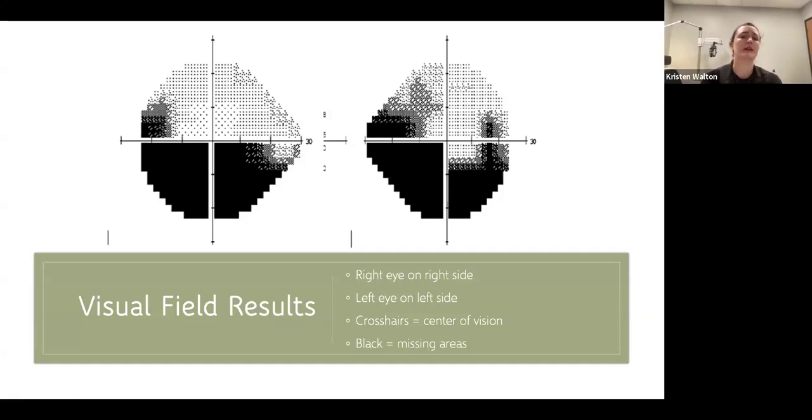I think I typically prefer fovea on. Just getting as much feedback from the machine is what I would prefer. But it's definitely doctor preference. Just like when patients come in and maybe mid-exam, you decide you want to have a visual field, and some doctors prefer dilated versus undilated fields. Undilated is probably going to give you a little bit better estimate of what the patient's truly seeing. But for a baseline, I think I could go either way, undilated or dilated.